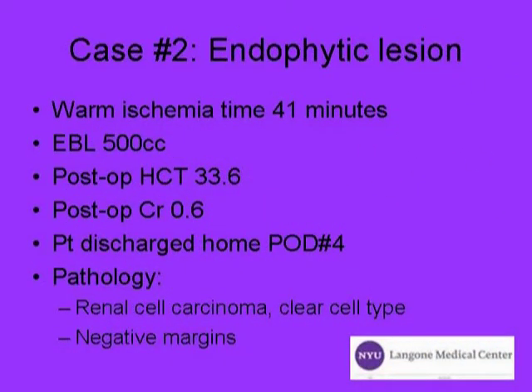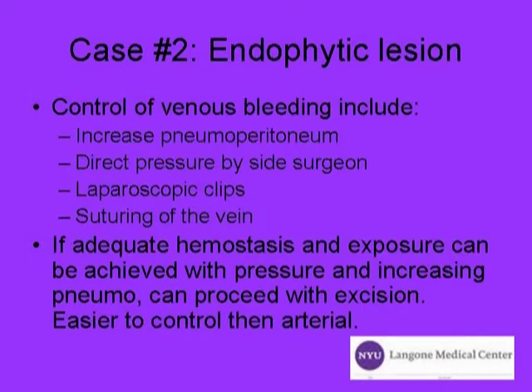Warm ischemia time is 41 minutes, the estimated blood loss is 500 cc, and the patient was discharged home post-op day 4. Controlled venous bleeding can be achieved with increasing the pneumoperitoneum, direct pressure by the side surgeon, laparoscopic clips, or suturing the vein. Excision of the lesion can be completed if hemostasis can be achieved.